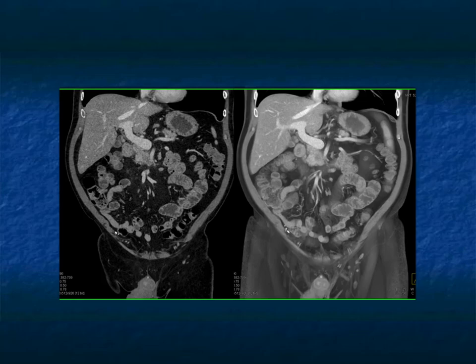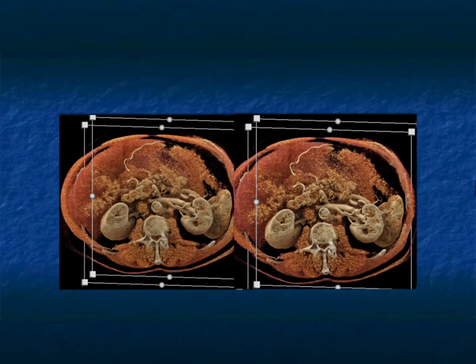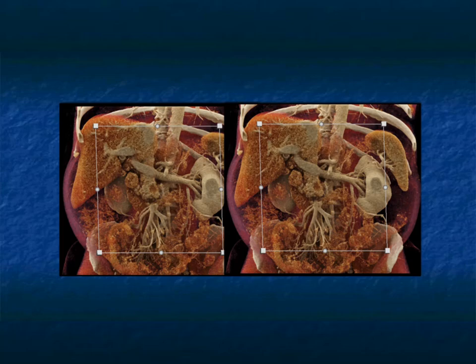You can look, the portal vein and SMV look good, and yes, you should see the lesion, though it's better seen on volume rendering, and it's surely better seen with texture mapping on cinematic rendering right there. And again, on the coronal views, it's particularly well seen. Again, it's a good example of showing you how much easier it is to see.